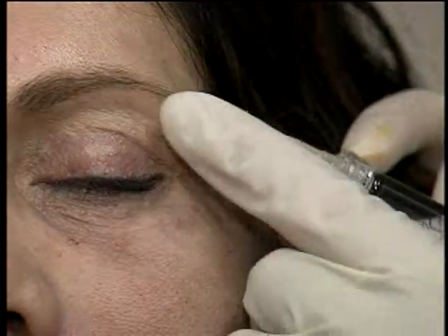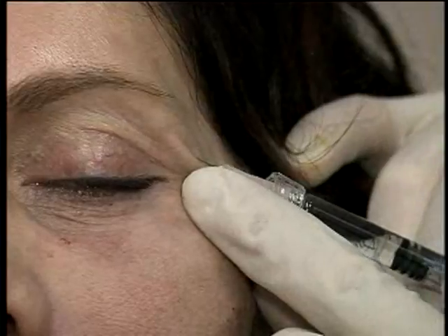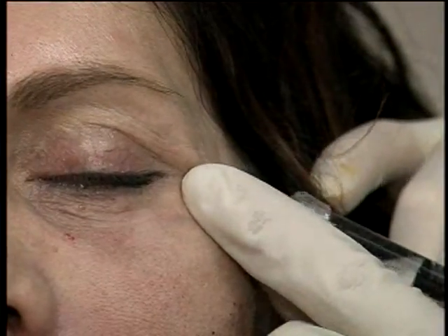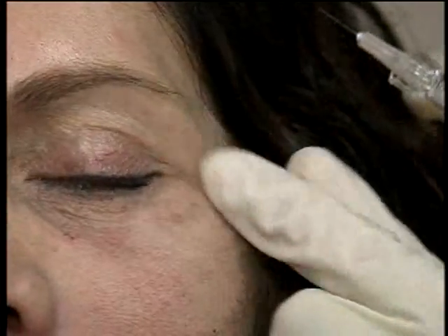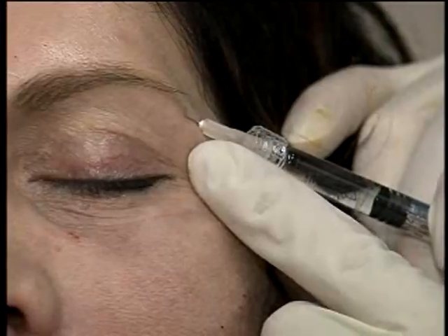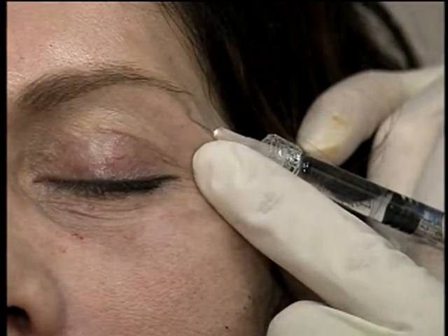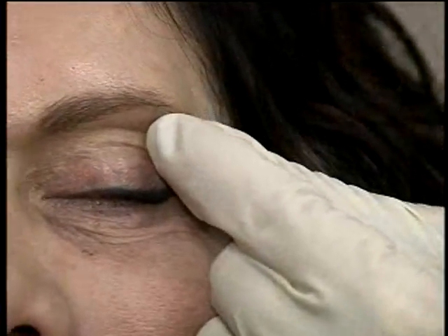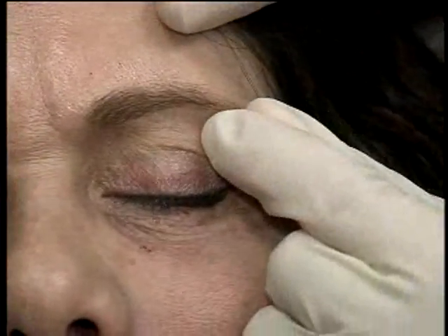Threading method. And I come out here over the orbital rim, underneath the brow, massaging it into place.